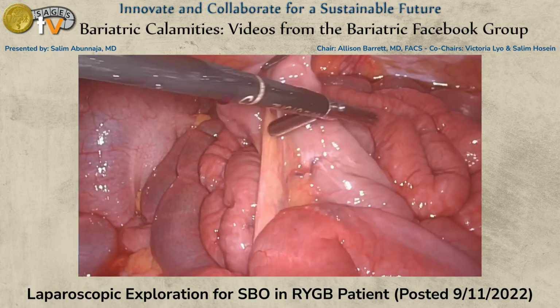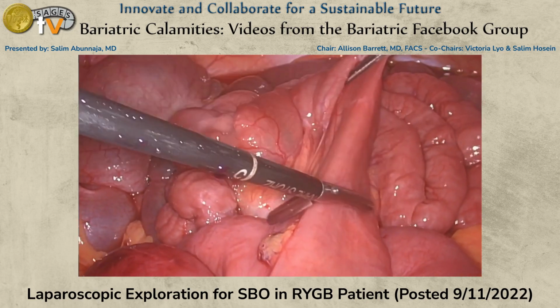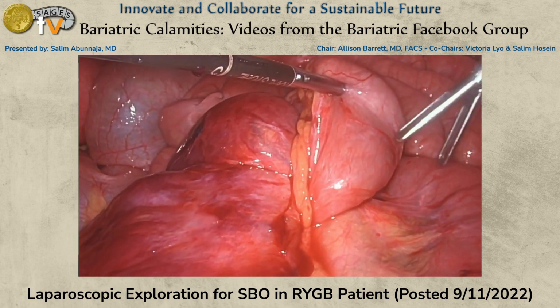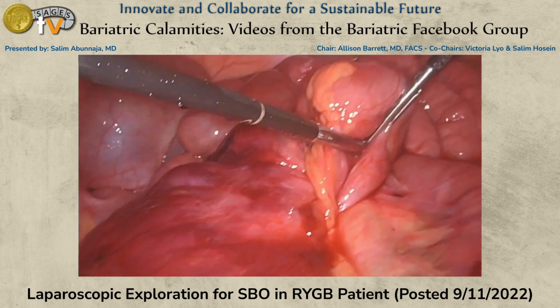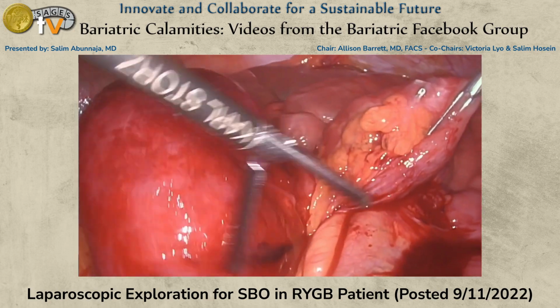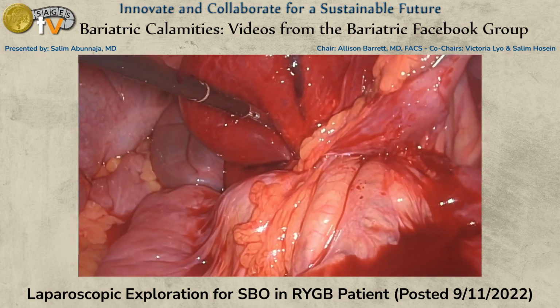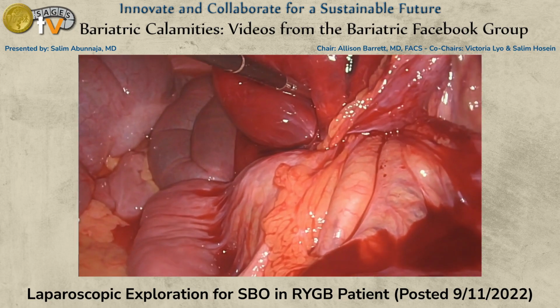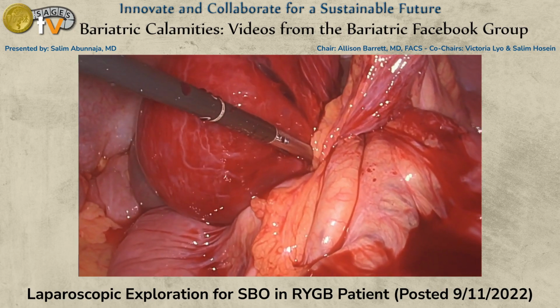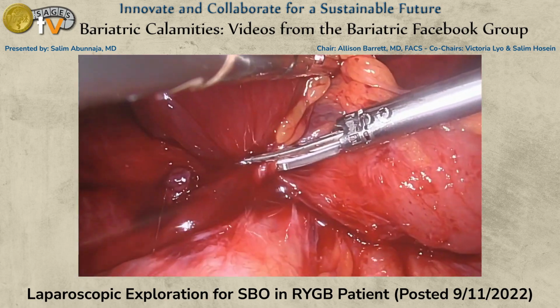And as soon as we got in, we started running the bowel. This was a very simple, straightforward case. It was a simple band that had created this closed loop bowel obstruction. Because it's overnight, the staff did not know what to open. They opened everything they had, so I had a Sonicision available. I got many questions about that on the Facebook group: why did you use a Sonicision? I'm like, it was just open there, so I just used it. It's a very simple, satisfying case.